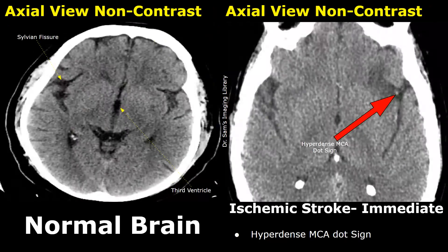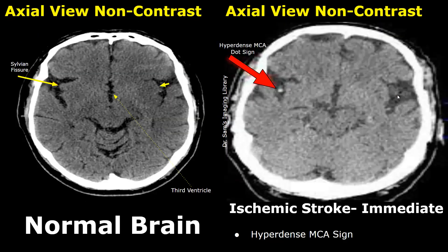A bright dot or hyperdense dot may appear in some cases of ischemic stroke. So instead of seeing a hyperdense MCA, we may see a hyperdense dot within the MCA. Here is another image showing a hyperdense MCA dot sign within the sylvian fissure.